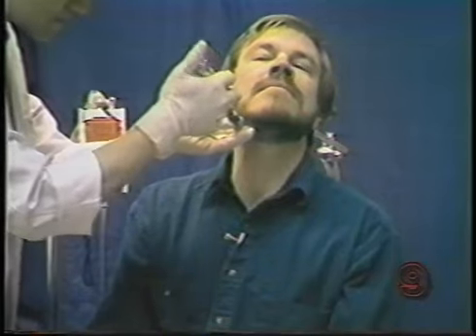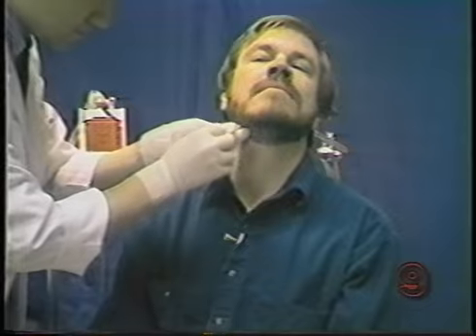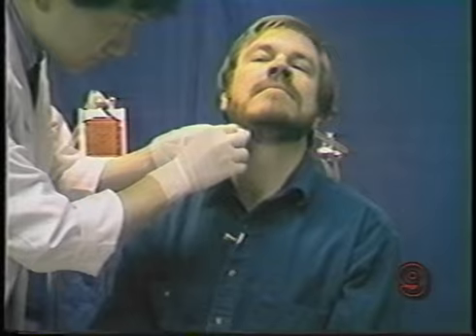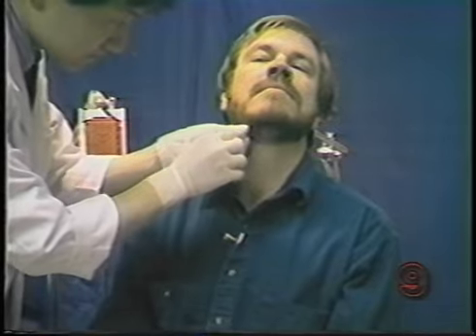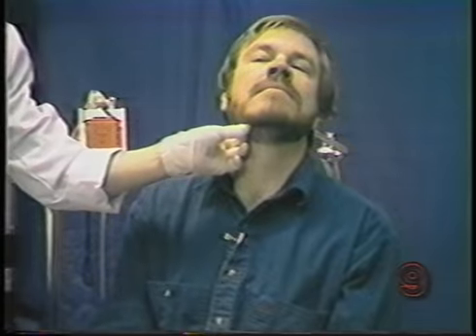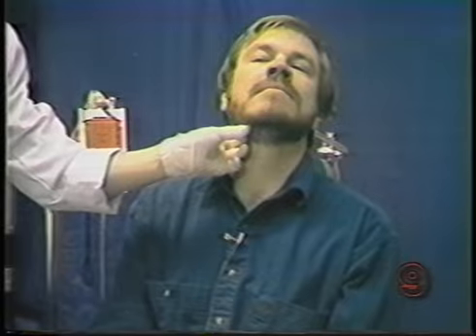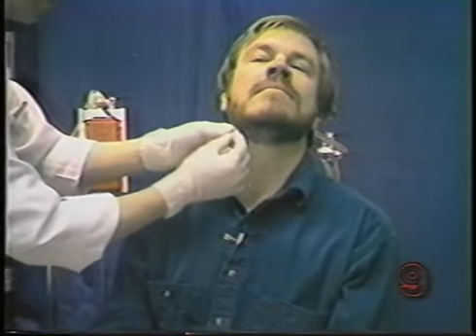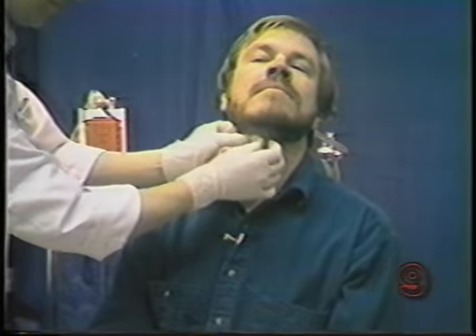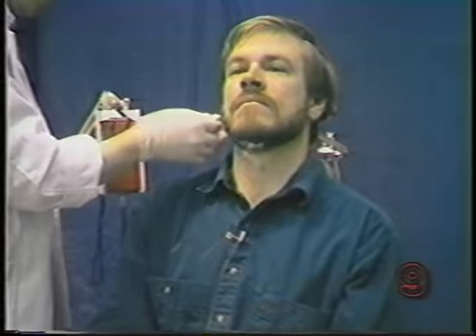After application of topical anesthetic with a panjet, a bipolar hooked wire electrode is being inserted into the medial pterygoid muscle of this subject. And then a ground electrode will be applied to his ear.